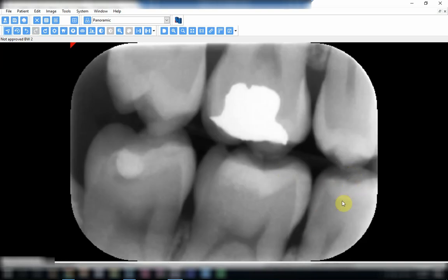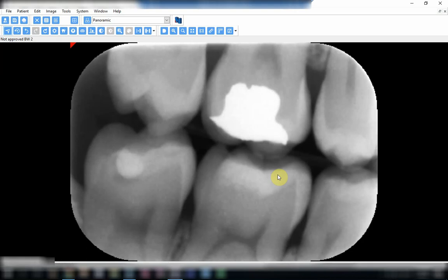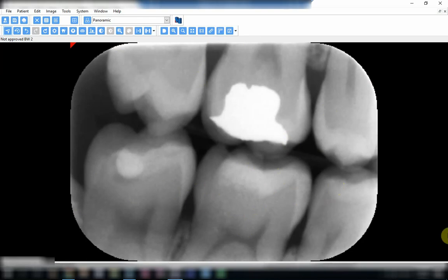This is an example of a relatively good radiograph for the molar teeth — six and seven on both sides. The horizontal and vertical angulation are okay and the sensor is completely covered. However, there is a small mistake: the film is slanted. The coverage of the lower teeth is more than that of the upper teeth, meaning the film did not follow the arch of the teeth — it was pushed downwards.